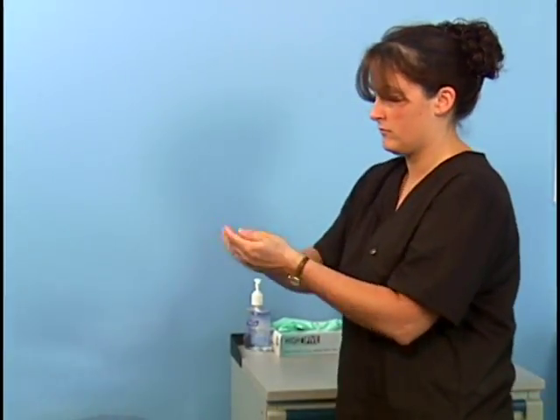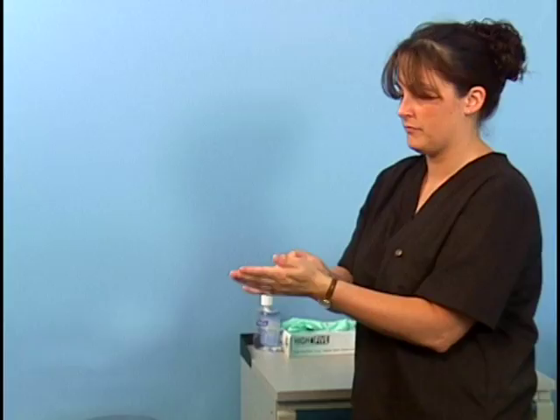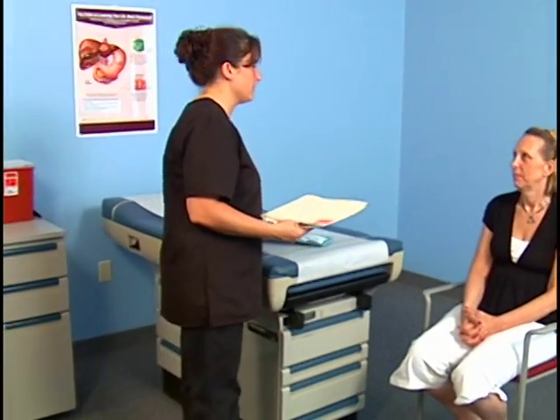Before proceeding, sanitize your hands. Greet the patient and introduce yourself. Identify the patient by asking the patient to state his or her full name and date of birth. Compare this information with the data in the patient's chart.